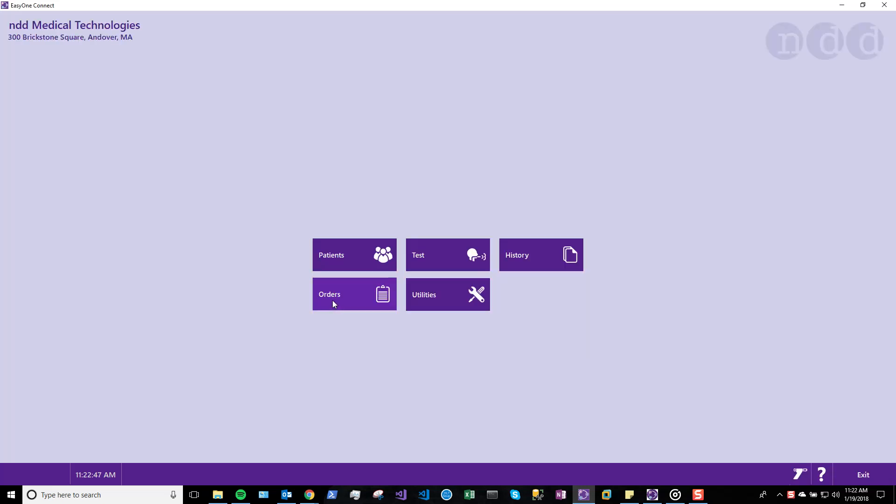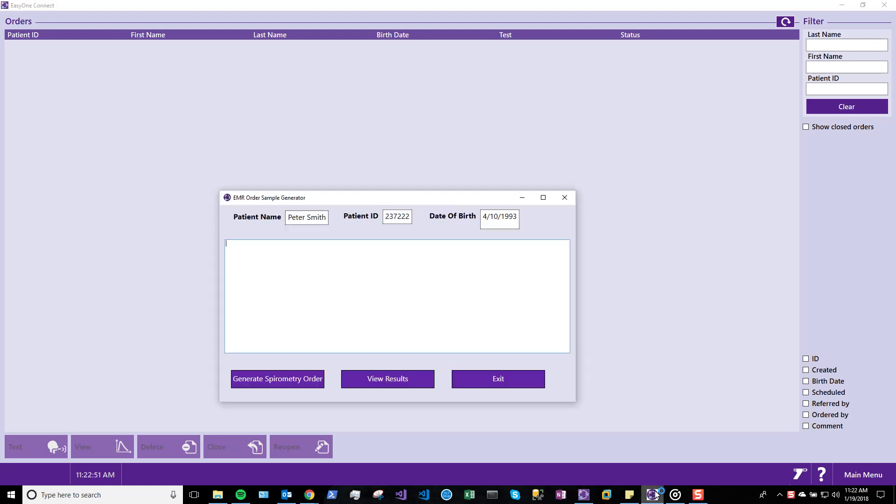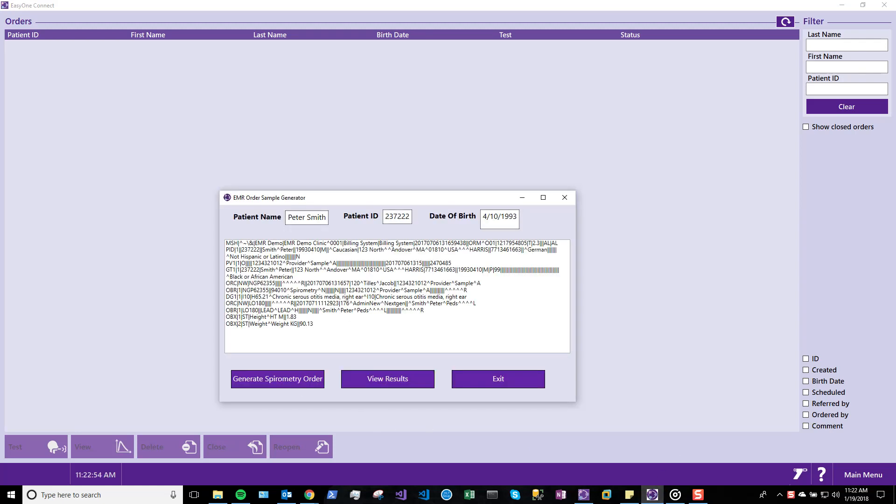Select the Order screen. We will generate a spirometry order using a virtual EMR. The patient data appears at the top of this screen. This example order is generated and automatically loaded into EasyOne Connect.